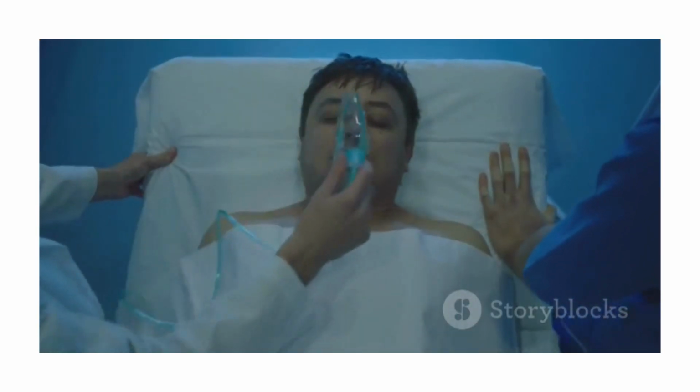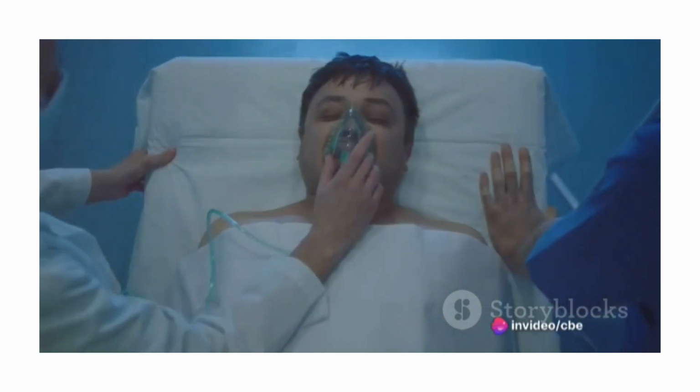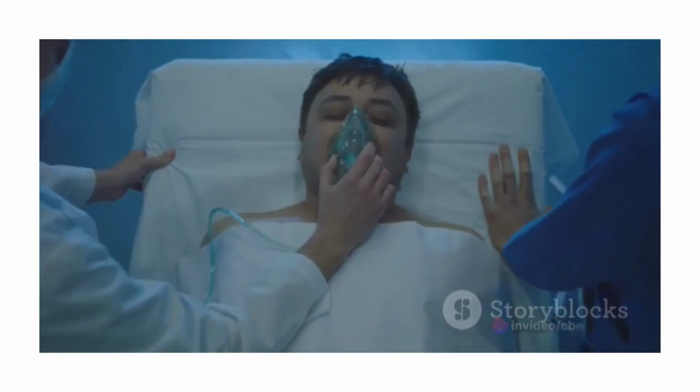Next, the medical team prepares the patient for extubation. This involves explaining the process to the patient, suctioning secretions from the airway, and positioning the patient appropriately.